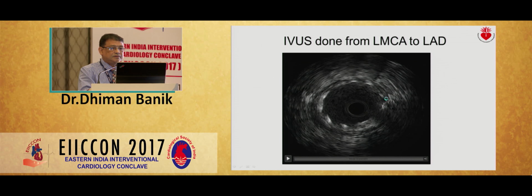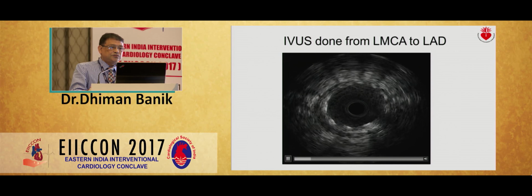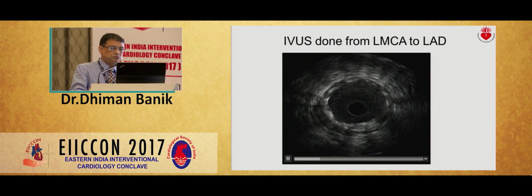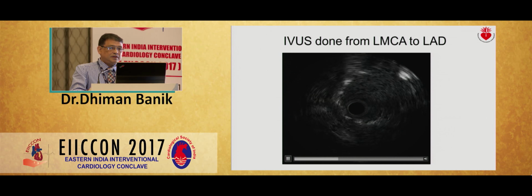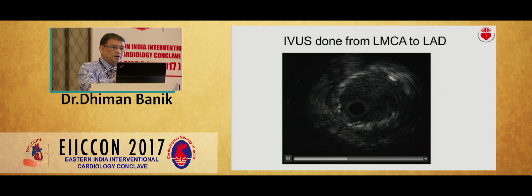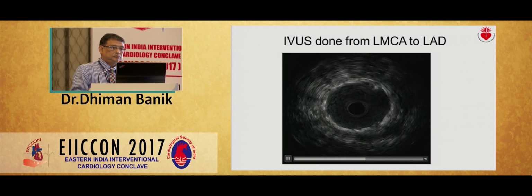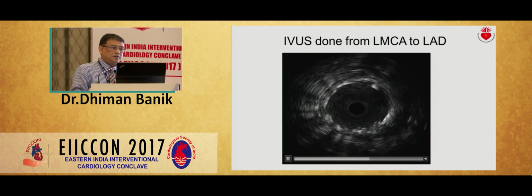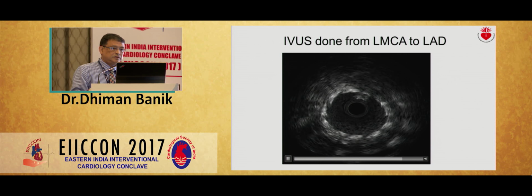Then I did an IVUS. From left main to LAD, the LAD stent is well apposed. Could you show us the ostium of the left main? Yes, ostium of the left main. Yes, this was the bifurcation. Then this is the left main double stent, well apposed double stent.